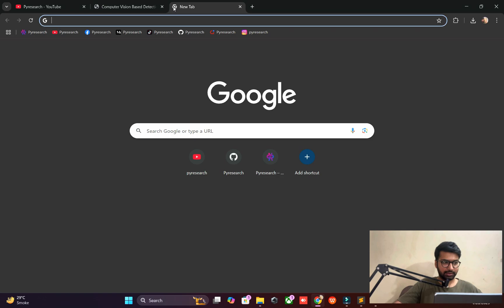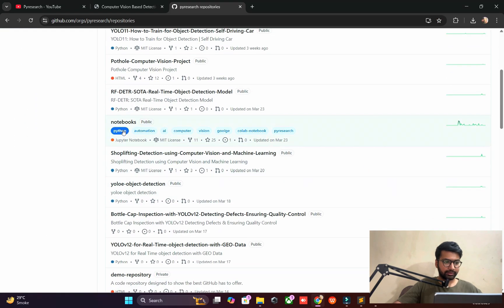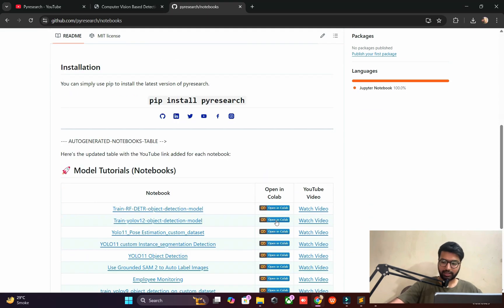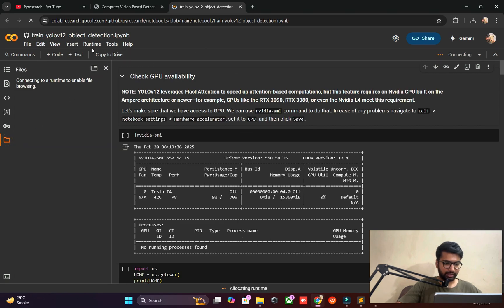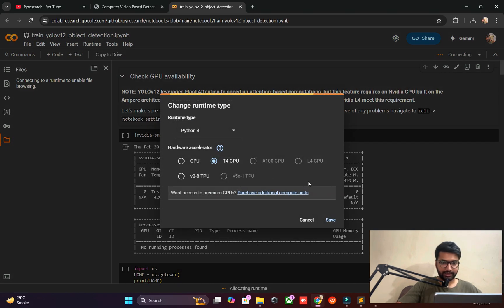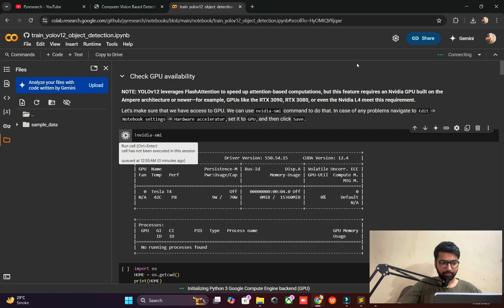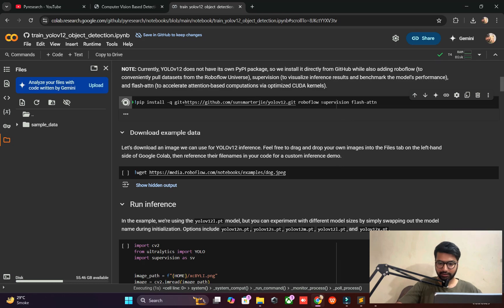First, go to GitHub and find the notebooks. We will use the YOLOv12 model, choosing the detection part with YOLOv12. Set the runtime — change to T4 Tesla GPU. The runtime is limited since this is an open source environment. YOLOv12 dependencies will be installed as needed.